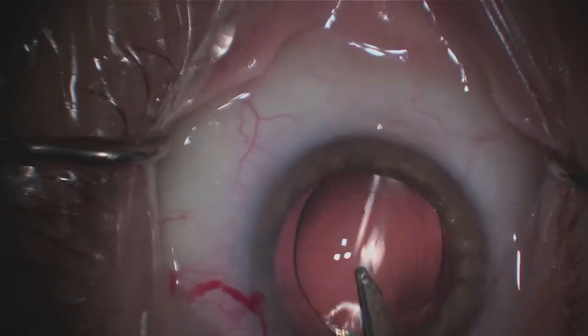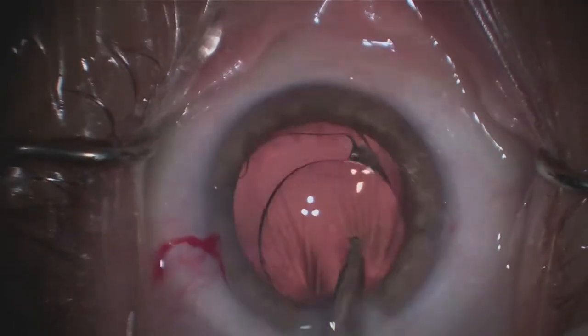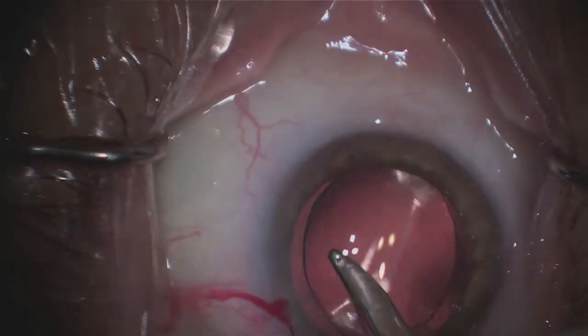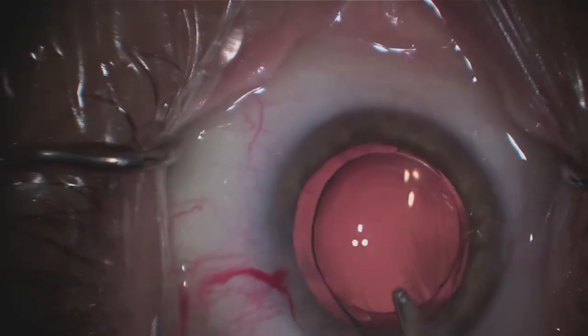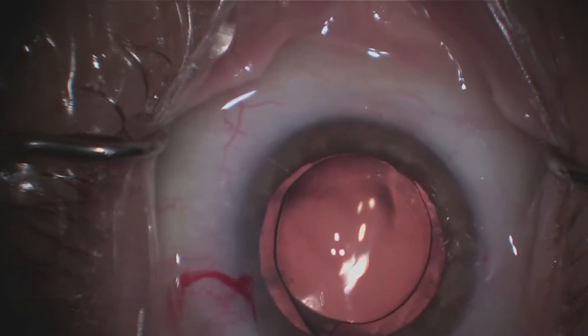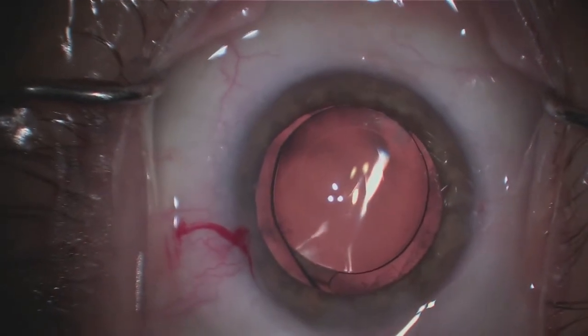The lens is now in place. I'm cleaning up, removing some of that gelatinous material, and positioning the lens. This essentially completes the surgery — all within about eight minutes. Thank you so much for watching, and I hope you enjoy your vision.